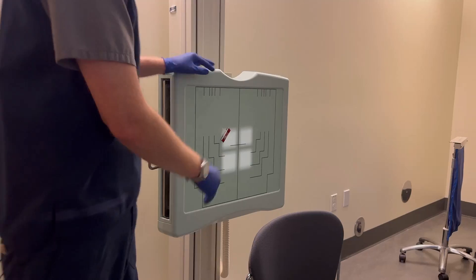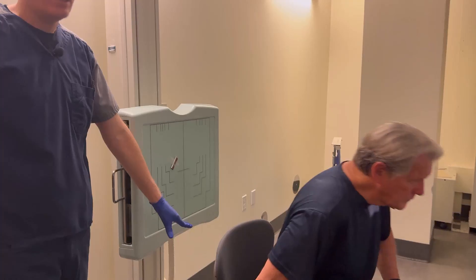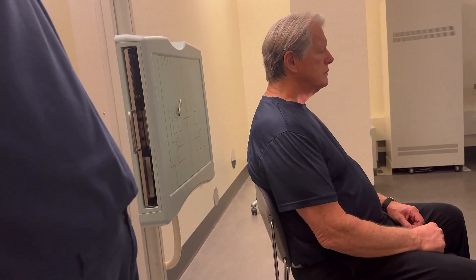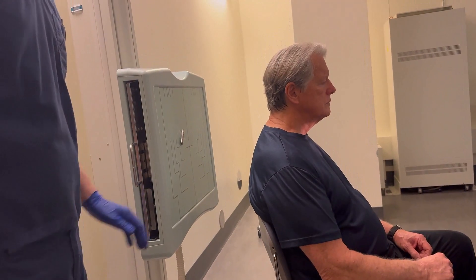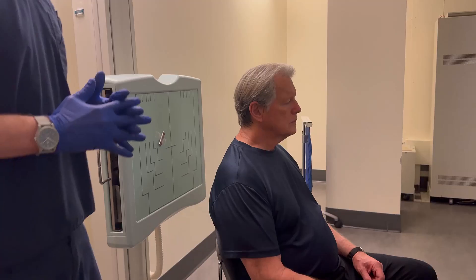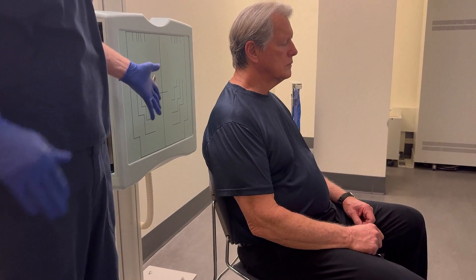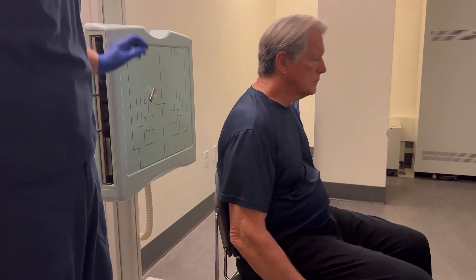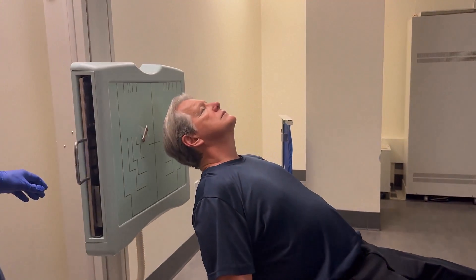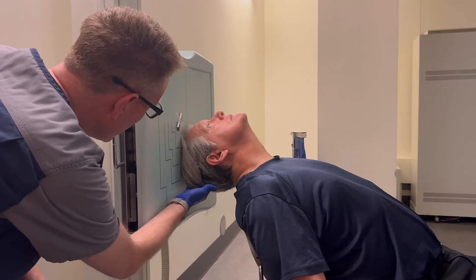I'm going to have my patient come over and have a seat. He'll be facing the x-ray tube. You want a space between your patient and the board so that they can lean back all the way. If they're sitting very straight up in the chair, they're not going to be able to get their head in the right position. I recommend that the patient kind of slouch forward on the chair — just shift the hips forward. Then as you're leaning back against the chair rest, just raise your chin and rest your head against the top of the bucky.